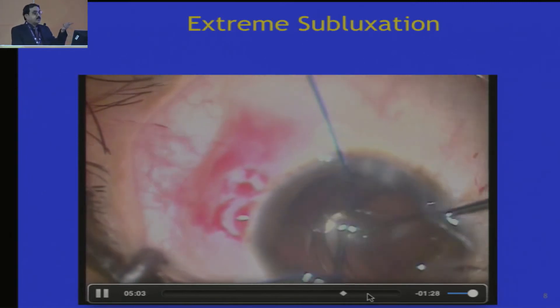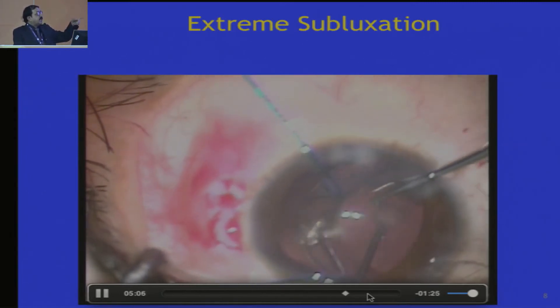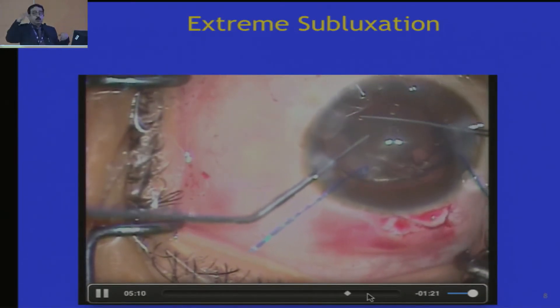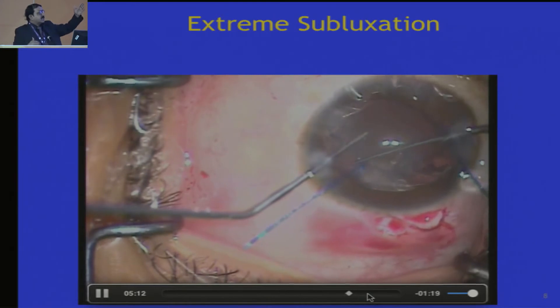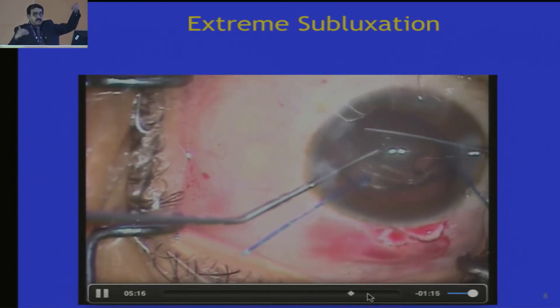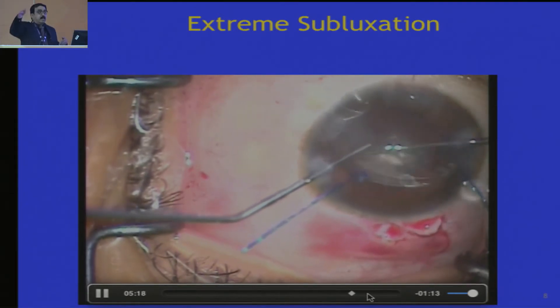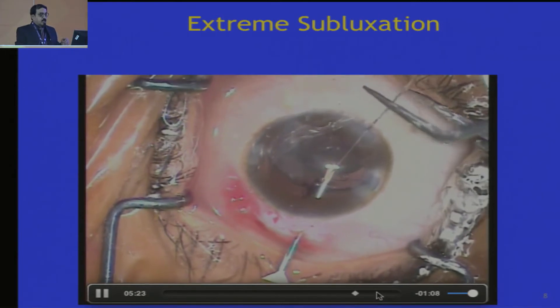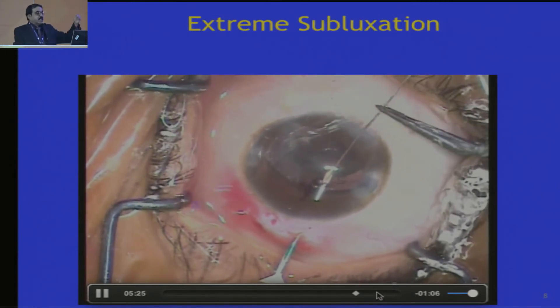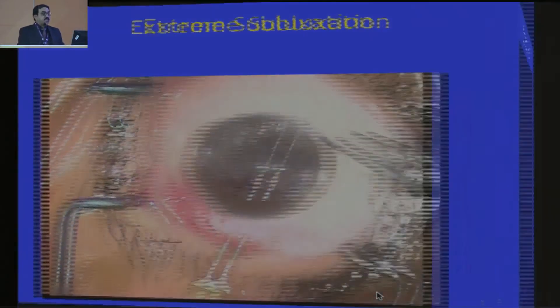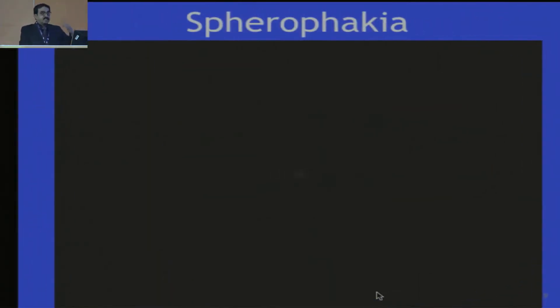Placing an intraocular lens in such conditions is also important. Here I am placing the intraocular lens through the nasal side — because the subluxation is on the temporal side. If I try from the temporal side, negotiating the capsule is difficult. You have to do a good suturing, and in case you need to, check the centration as shown.